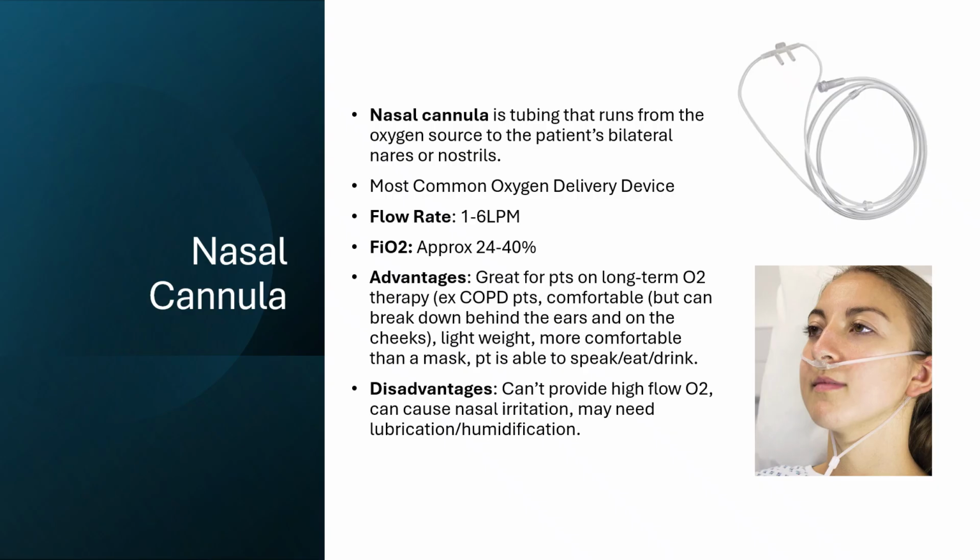It's also nice because it's lightweight and it's more comfortable than a mask. People don't typically feel claustrophobic with it, and patients are able to speak and eat and drink with this in place. Now, the bummer of this is that you can't really provide high flow oxygen, and it can cause some nasal irritation, even at that 4 or 5 liter per minute.